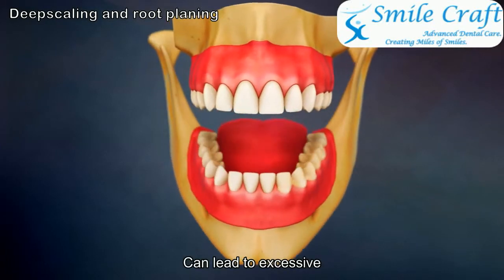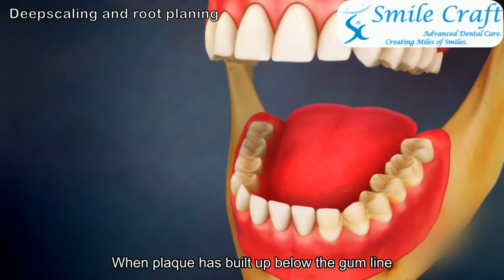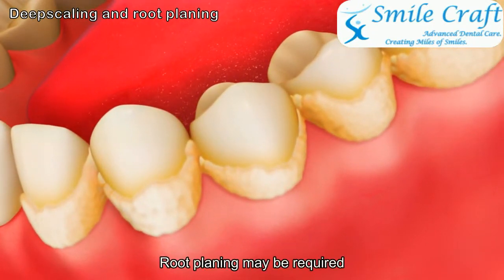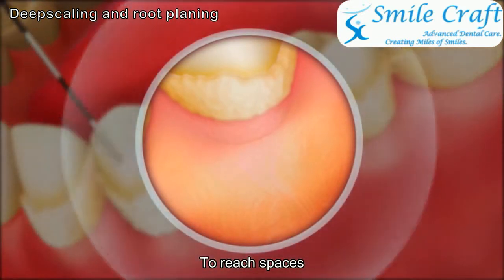Improper brushing can lead to excessive plaque buildup. When plaque has built up below the gum line onto the root surface, root planing may be required to clean these hard-to-reach spaces.